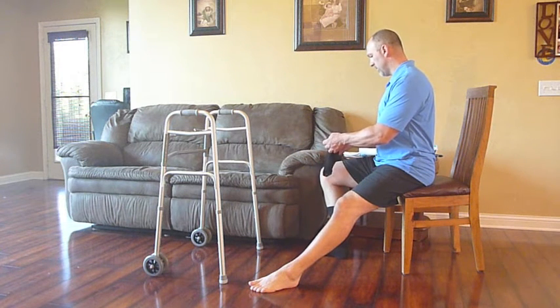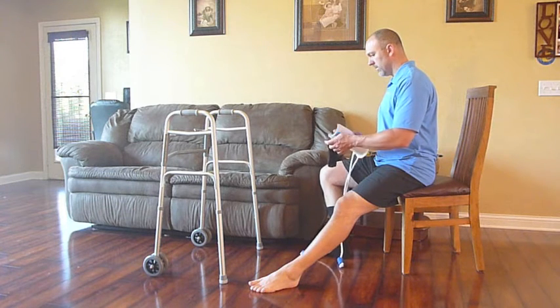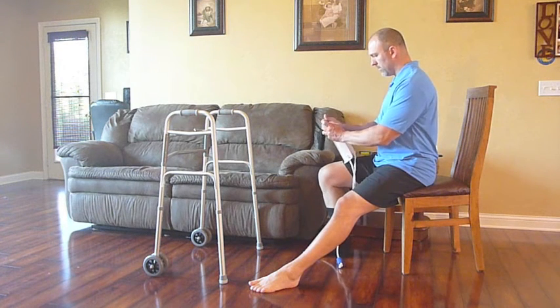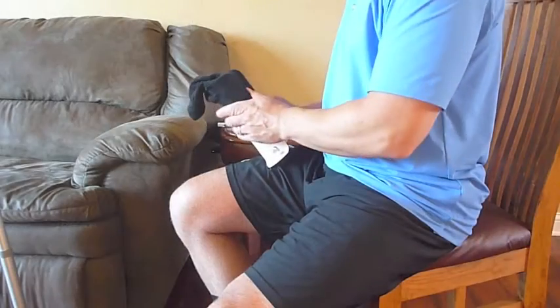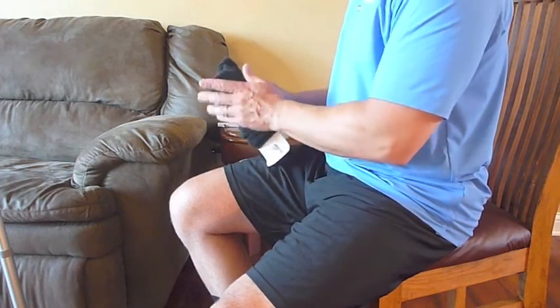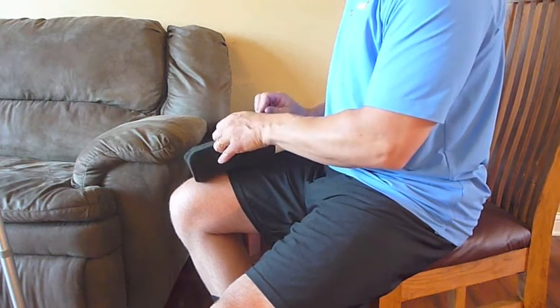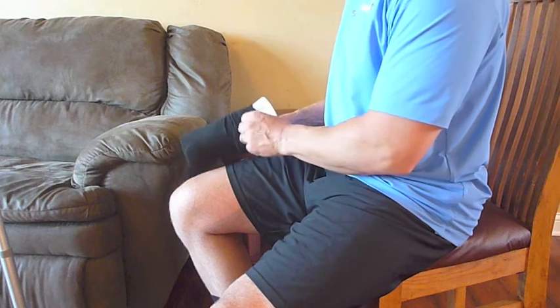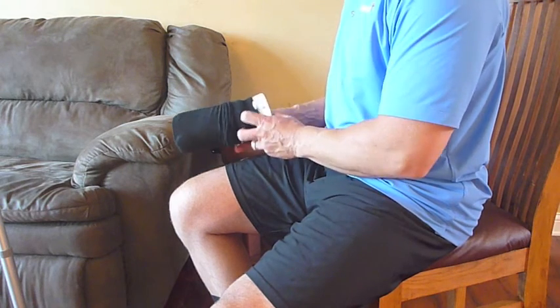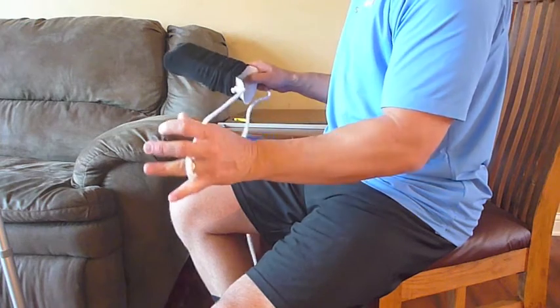Scrunch up your sock and place the sock over the front of your sock aid. Make sure the sock is adjusted well so your foot can slide into it easily. Keep the upper cuff of the sock smooth towards the top of the sock aid and make sure the sock is scrunched up evenly.